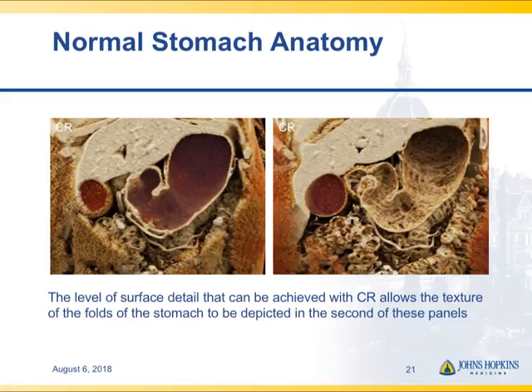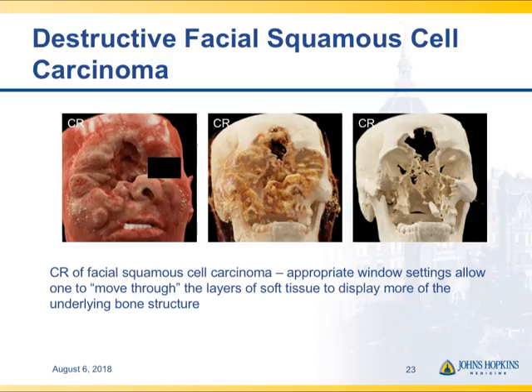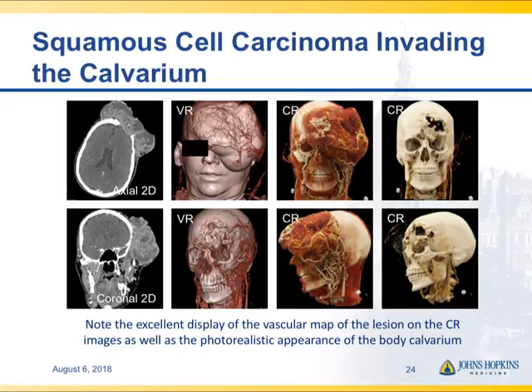Look at the stomach and gastric folds — the image on the left shows cinematic rendering with the fluid in the stomach, and then I take the fluid away to reveal that fold pattern. Very impressive. For clinical applications, here's a large destructive squamous cell carcinoma with bone destruction and orbital destruction. You can see the defect from muscle to soft tissue to bone, with this large squamous cell carcinoma invading the calvarium, seen from axial and coronal images showing the extent of the tumor. Very good visualization of very bad disease.